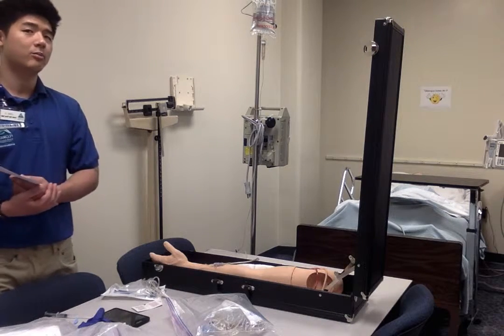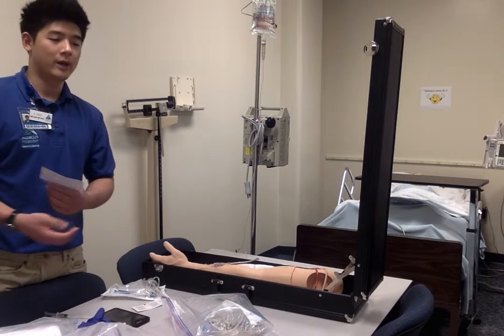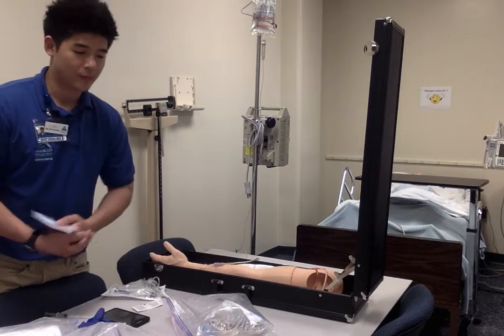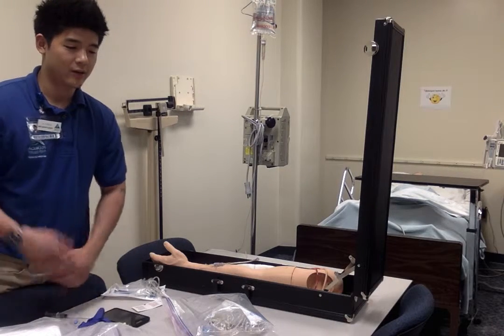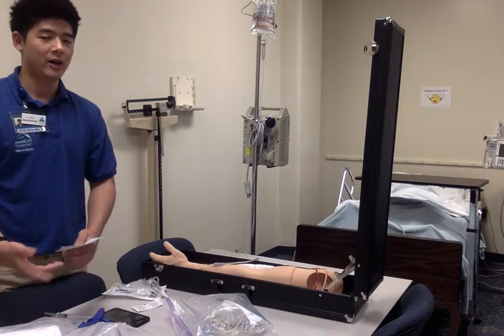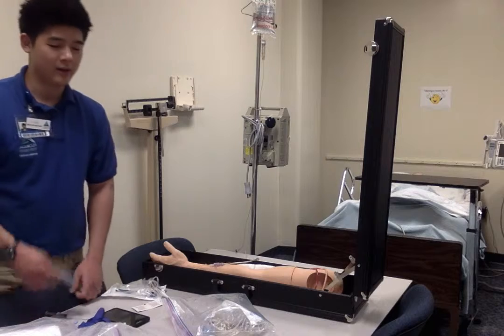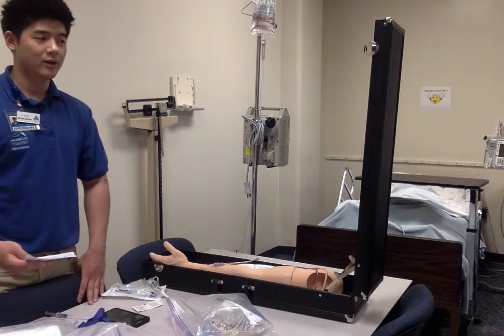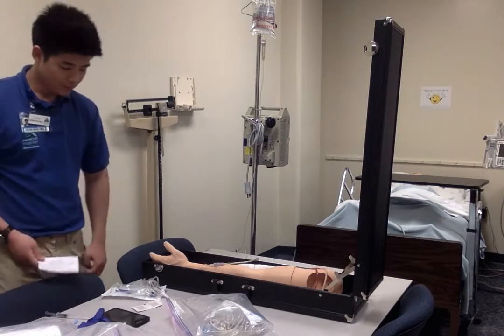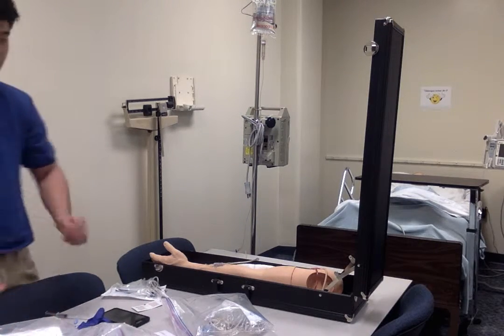And it is particularly important to note that when you're trying to cure the C. diff pathogen or kill them, you have to take the antibiotics orally. And until then, any other bacteria that you have, you might want to give as an IV to effectively kill them. So, first thing is first, I'm supposed to draw out my medication.